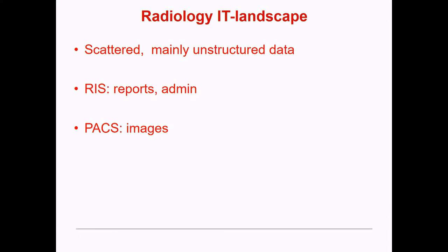And then the images in themselves are also unstructured in the sense that, well, we know their format and we know their intensities, but usually only a fraction of all the imaging elements, or voxels as they are called, because they're 3-dimensional, in radiology, contain medically relevant information. Like if you have a tumor infiltrating somewhere, this infiltrating somewhere is maybe 5 voxels out of millions that you have in a whole data set.